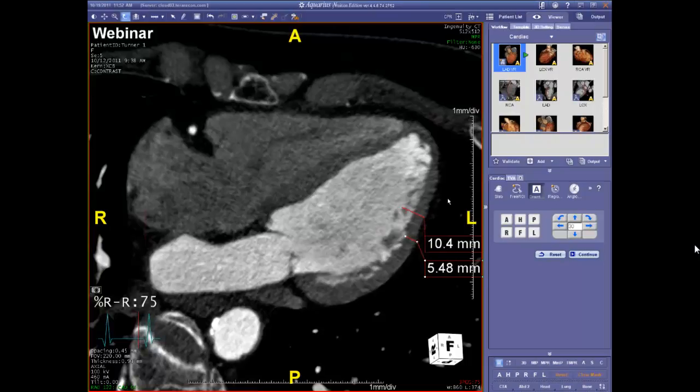These measurements don't necessarily transfer one modality to another - there's a lot of variability. But we do have the ability to really accurately look at these crypts and see how deep they are. The trabeculations are certainly exaggerated in this patient. So could this be a non-compaction cardiomyopathy? I think the answer is yes, it could be. This is a relatively new disease and not everybody outside the academic environment knows a lot about it.